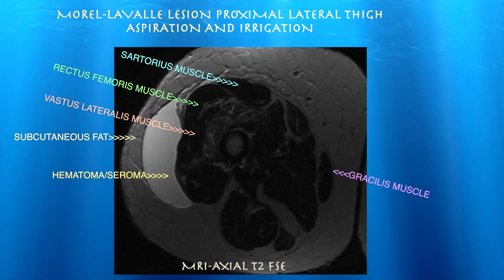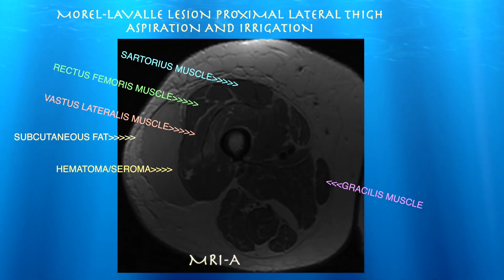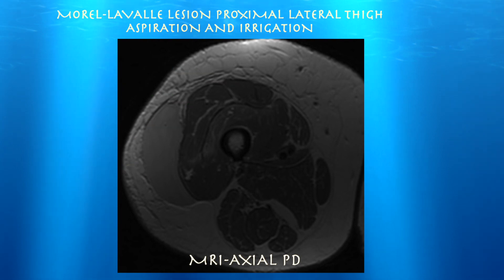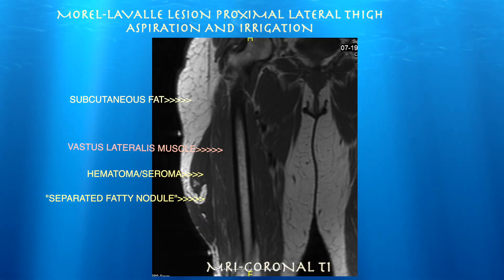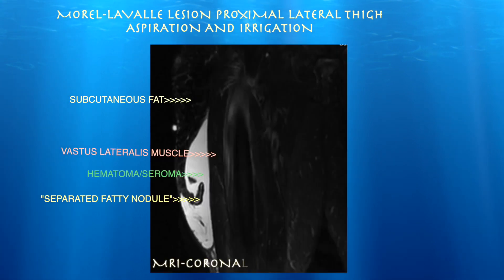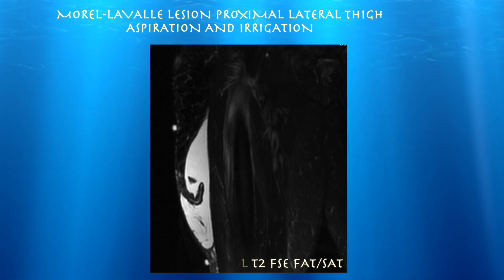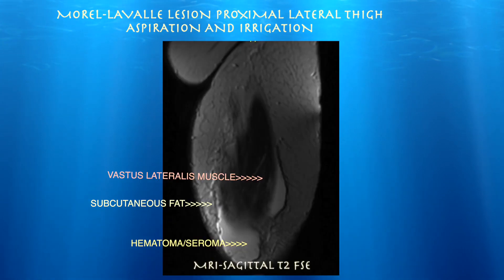Here's an axial MRI where you can see the muscle layers of sartorius, rectus femoris, vastus lateralis. Just lateral to the vastus lateralis, you have this very large degloving-type Morel-Lavallée lesion. Here's a fat-saturated coronal image where it just lights up, showing you how large this fluid collection is.